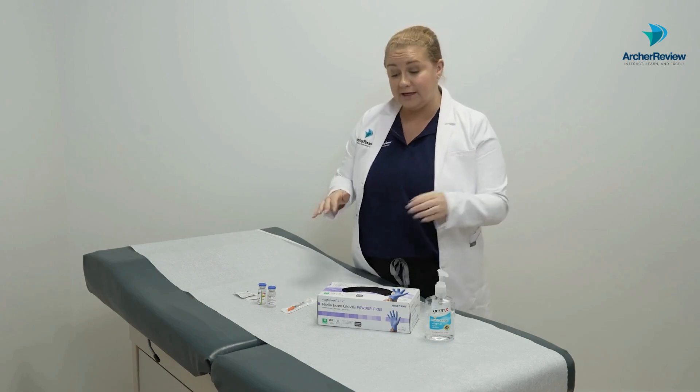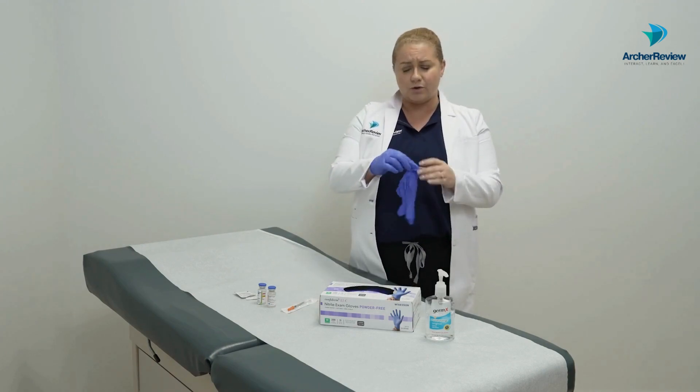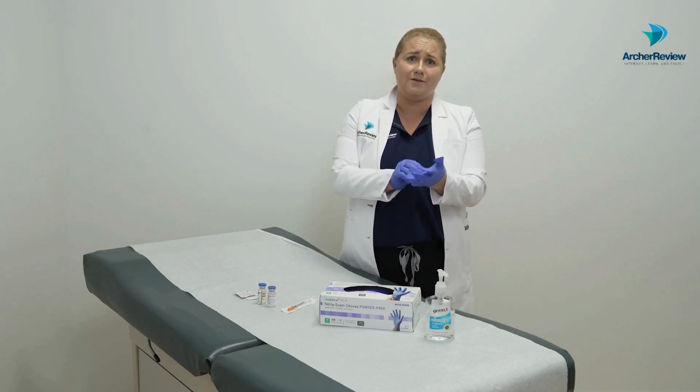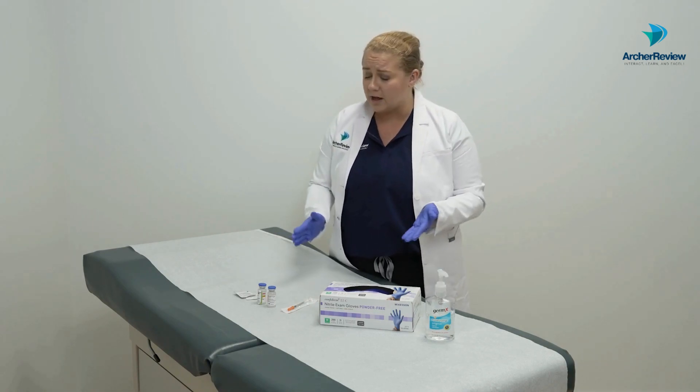Of course you're going to verify medication orders, double-identify your client, and all that good stuff — I've already completed that for this video. Once we come in and prepare our medications, we'll perform hand hygiene and don clean gloves. Anytime we're handling medication, especially something we're going to inject subcutaneously, we really want to make sure we're as clean as possible and not putting our germs onto these medication vials.